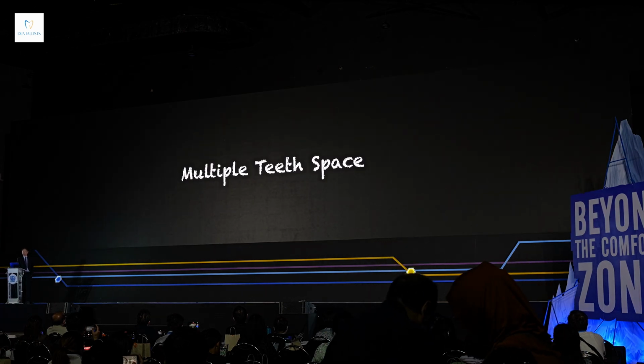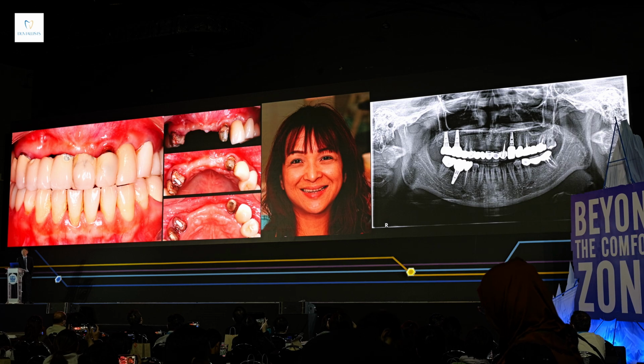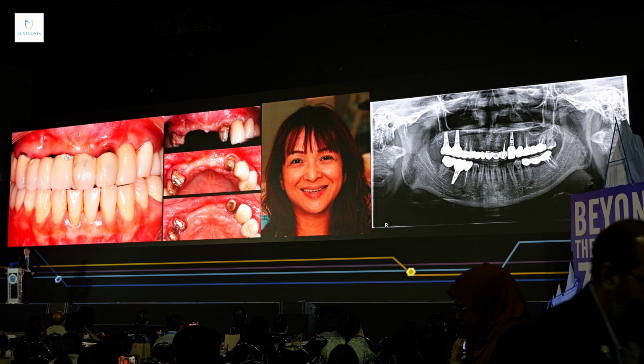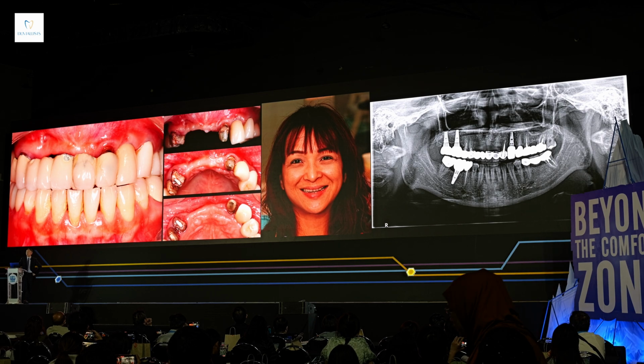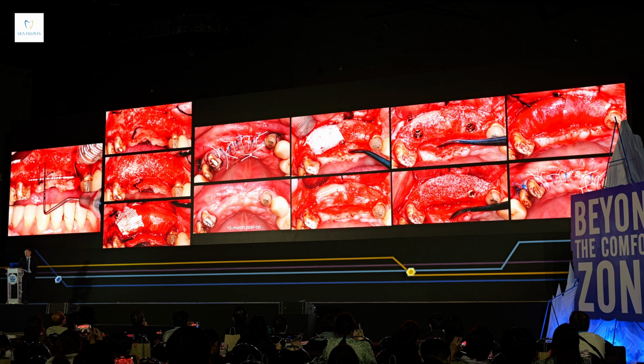What about a multiple teeth space? When we have a multiple teeth space, it's more difficult. The patient had this edentulous area treated with a couple of surgeries. There were a few failed bone augmentations and she was referred to my office. When I opened it up, it was not only horizontal bone loss, but vertical. You can appreciate that there was a lot of scar tissue, and the tissue apparently is not good enough. But I didn't do the soft tissue correction because it was good enough for augmentation.